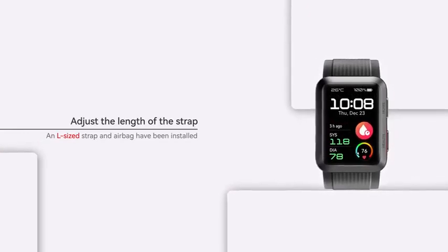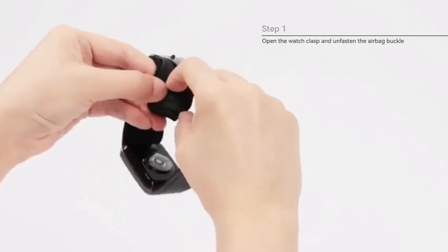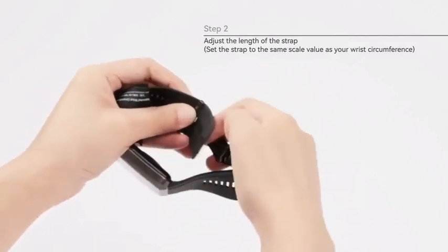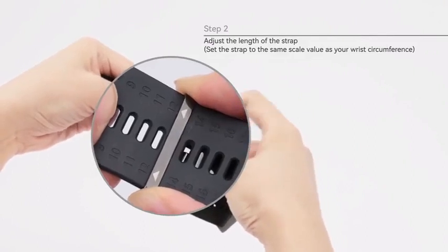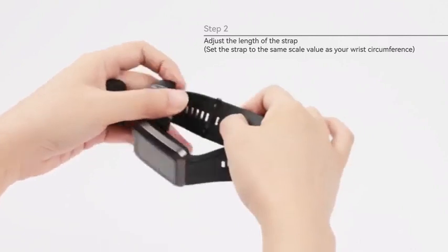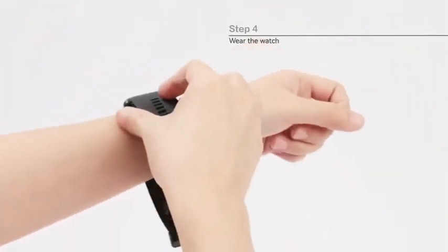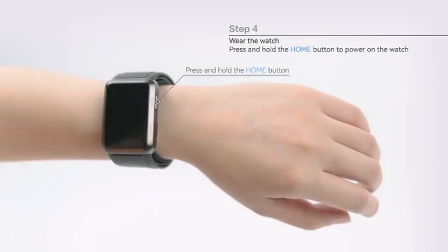Adjust the length of the strap. Step 1: Open the watch clasp and unfasten the airbag buckle. Step 2: Adjust the length of the strap and set it according to the measurement of your wrist circumference. Step 3: Fasten the upper airbag buckle. Step 4: Wear your watch. Press and hold the home button to power it on.